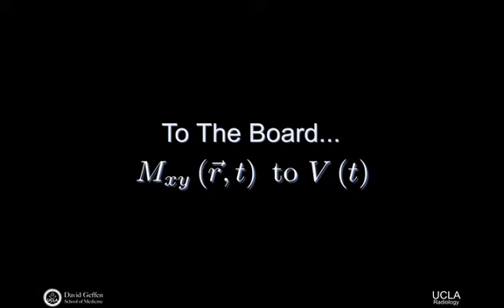Let's define just a couple more terms that will allow us to eventually get back to equation A, where we have the B receiver X term and the B receiver Y term. Conceptually, we write down those terms to say that our B receiver's X component is, by definition, just the magnitude of that B receiver's sensitivity, times some phase. So you could write this as a cosine of some phi from the receiver itself. I'll write the other one: we also have a y component, defined as the magnitude of the receiver's sensitivity times the sine of the phi of the receiver, as a function of space.